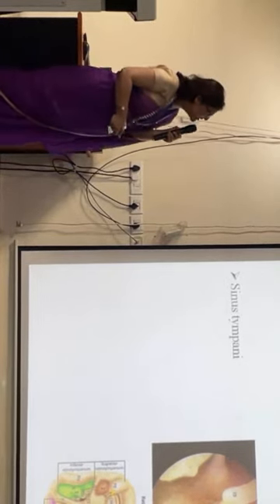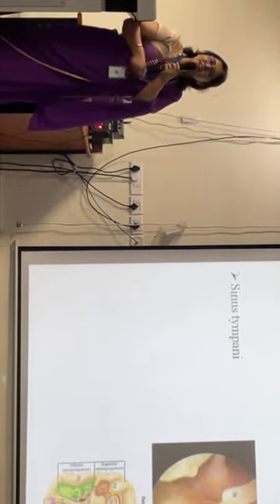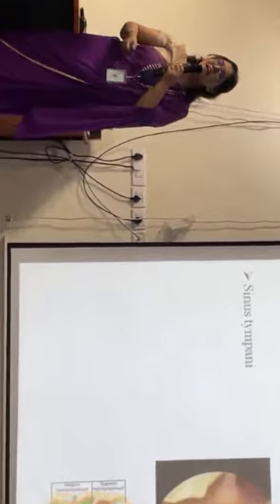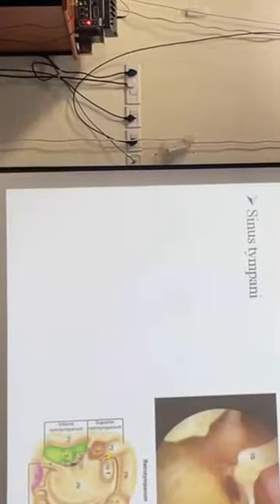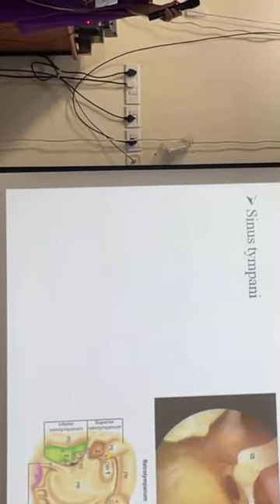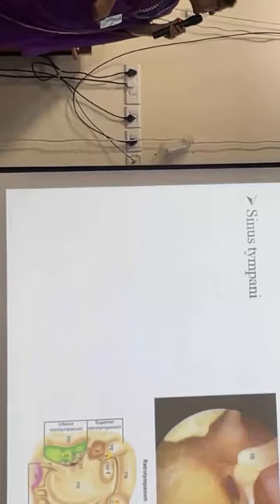So here, the fear of the facial nerve, going deep to the facial nerve, going medial to the facial nerve, that angulation, that change of the table position, change of the patient position, all can be prevented by using an angled endoscope. Going properly to the sinus tympani, visualizing it and removing the cholesteatoma in total. Here again, in this picture, you can see the retrotympanum, and how it can be divided into superior and inferior retrotympanum, going from oval window to round window. Clearing this part is much easier. We are more confident, more sure, with no residual if we are using an angled endoscope.